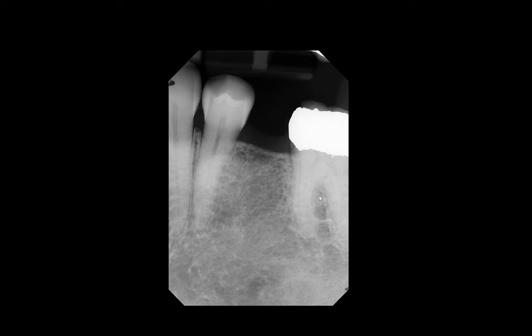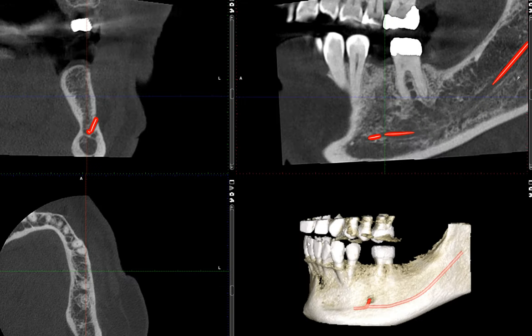Now let's take a look at this site under CBCT. Here we have that scan where I have conveniently traced the mandibular canal already.